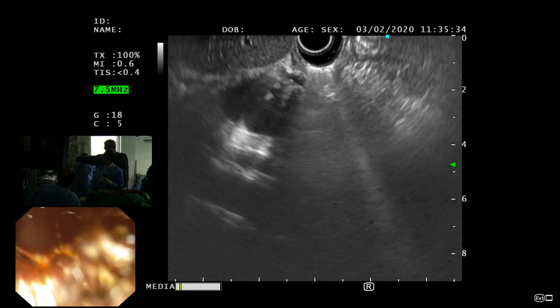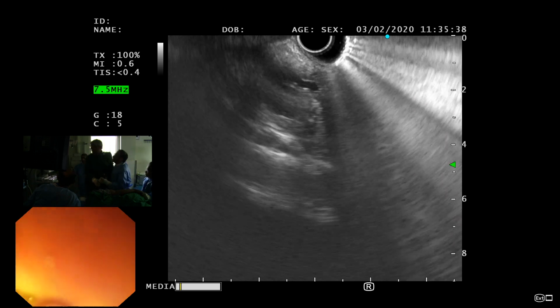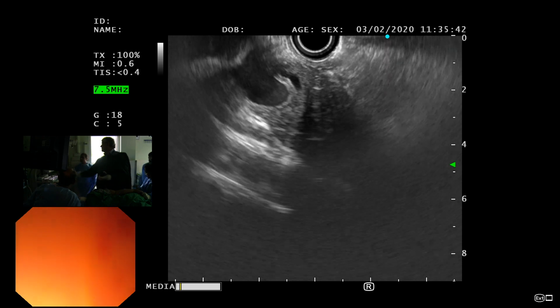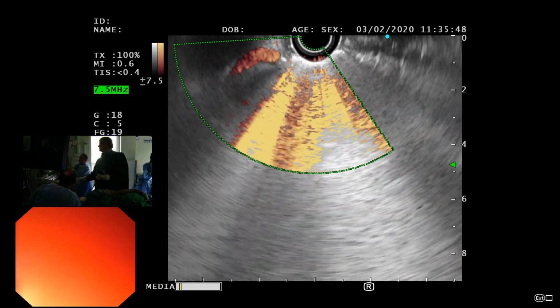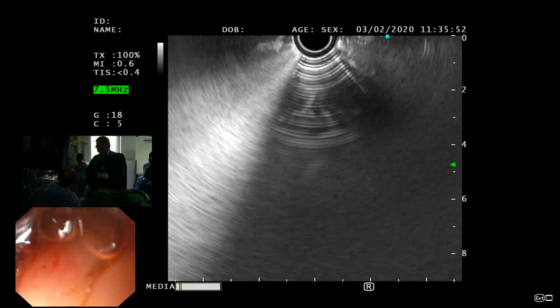That's the pancreatic duct. अब 1 मिनट दिखाएं आप, क्योंकि ये पैंक्रियास नहीं है. To move. ये पैंक्रियाटिक डक्ट है. डॉपलर दिखाना. Yeah, that's the pancreatic duct. Okay. सर इसके कर्सर के साथ मार्क करके बताएंगे कि कौन सी पैंक्रियाटिक डक्ट.